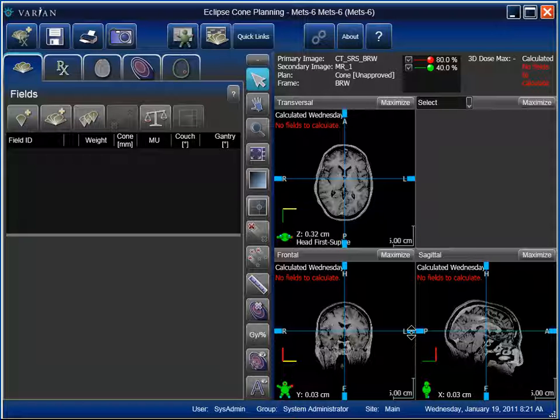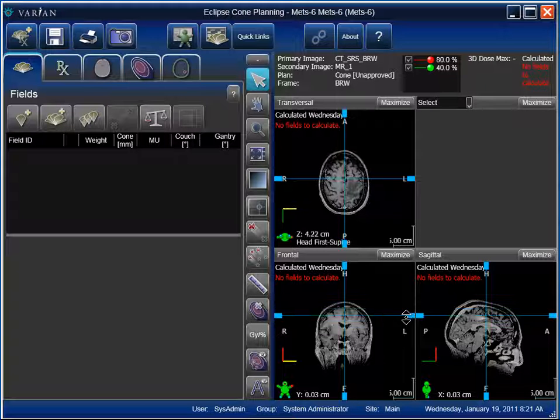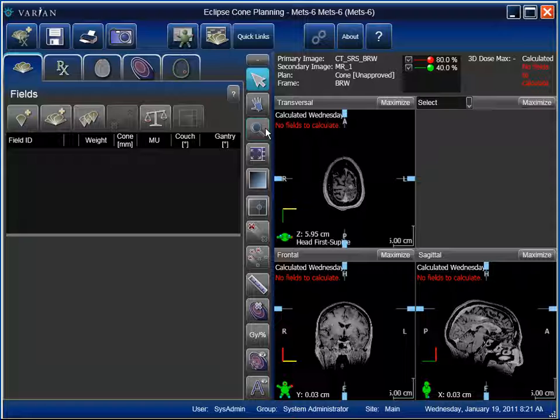Okay, this is the case now with two targets. These are two metastatic lesions. They are separate. We are scanning as before, up and down. We saw the first one. We then just saw the second one. We'll go back to the first target.